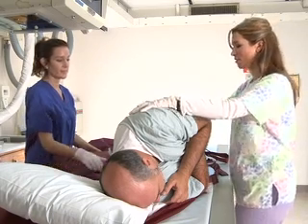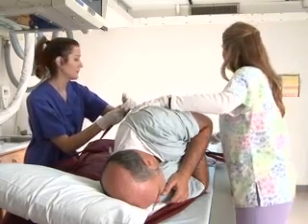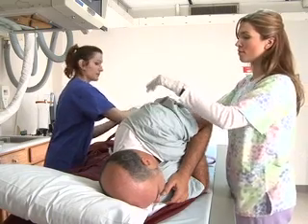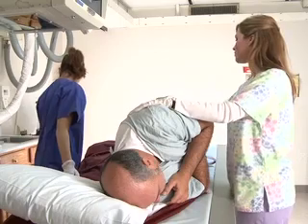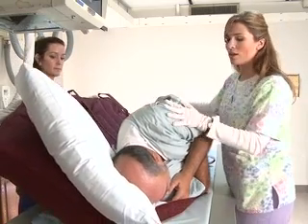HoverMatt. To return the patient to a supine position, attach the safety straps, inform the patient of the turn, and assume the same modified position of safety, with one hand on the patient's hip and the other on the shoulder. Have the other caregiver turn on the air supply.